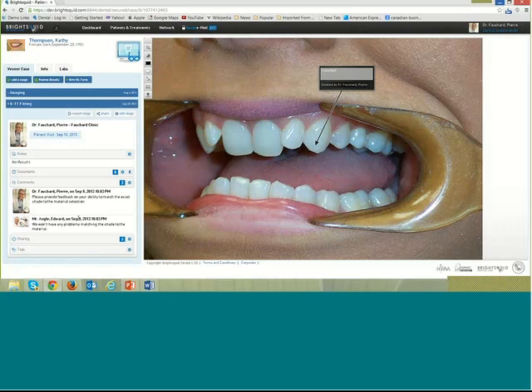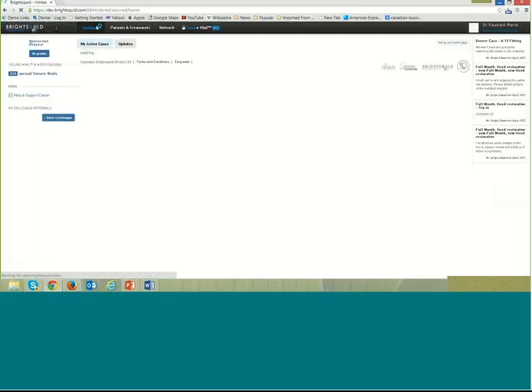I had a quick question. The other thing we had discussed when I saw this previously is there's an element of workflow, so the system can actually follow the stage something is in. Can you quickly show how that looks on the screen and how you can actually follow workflow in the cloud? Sure.